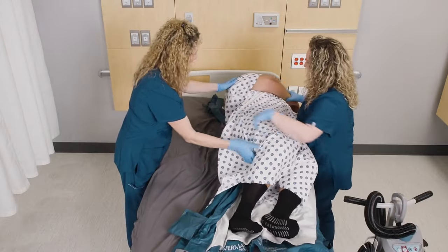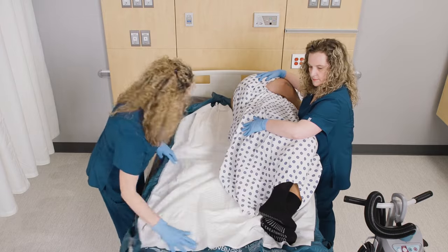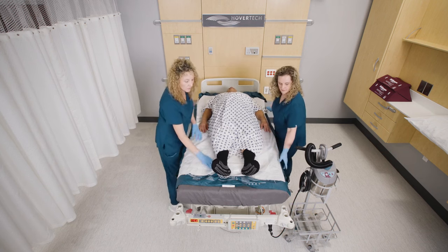Roll the patient onto their side toward the unfolded mat. Unroll the rest of the mat from under the patient to cover the bed. Place the patient back in a supine position. Straighten the mat to remove any wrinkles.